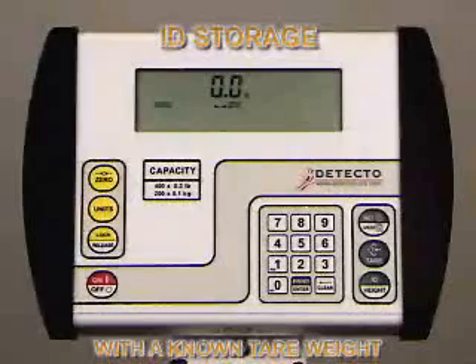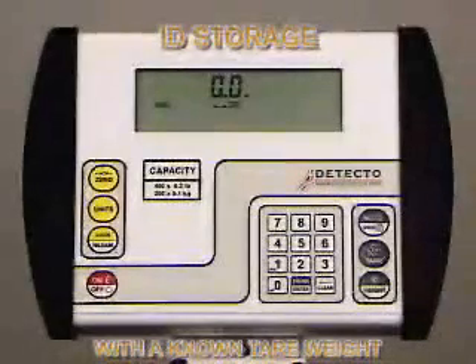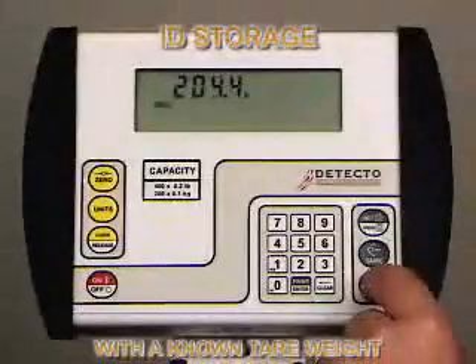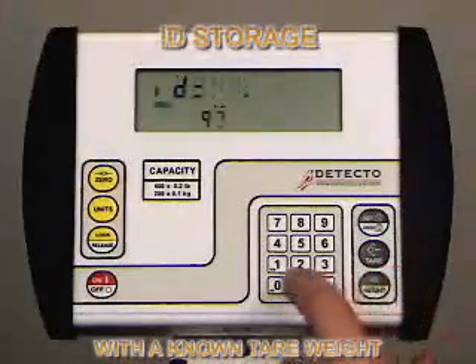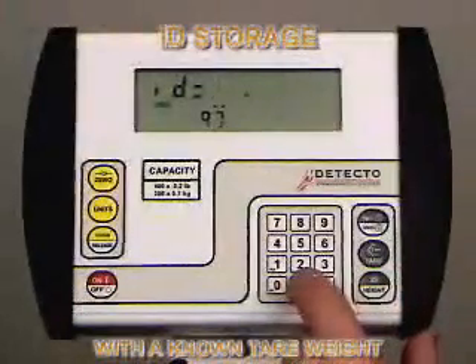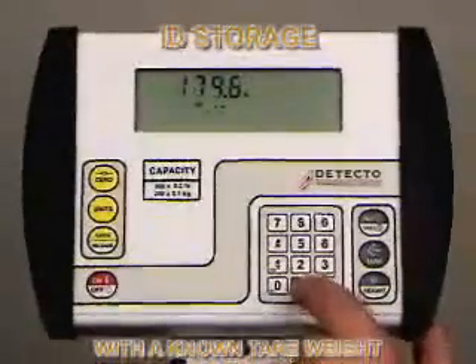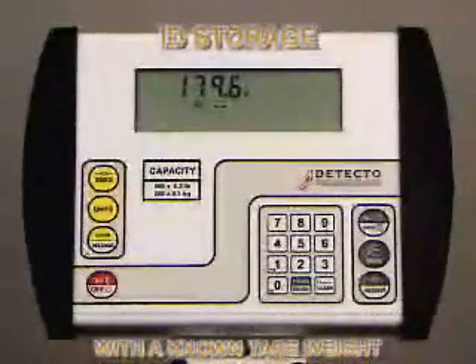Press the Gross key to return to normal weigh mode. To recall the ID while a patient is being weighed in their wheelchair or walker, press the ID Height key and the 758C will show the last ID entered. Pull up the value you want — in this case 97 — then push the Enter key. The indicator will go into Tear mode, displaying the stored value. If that is acceptable, press the Enter key. The indicator will go into Net mode.